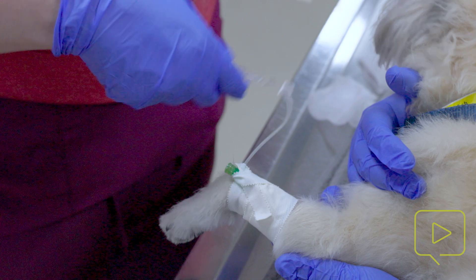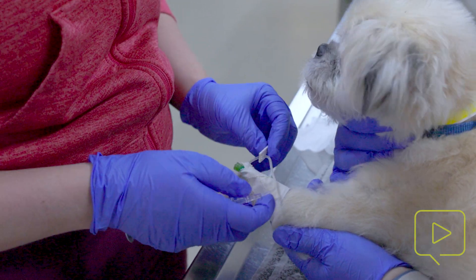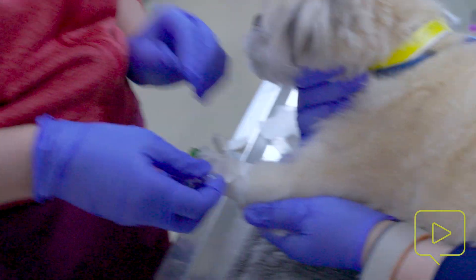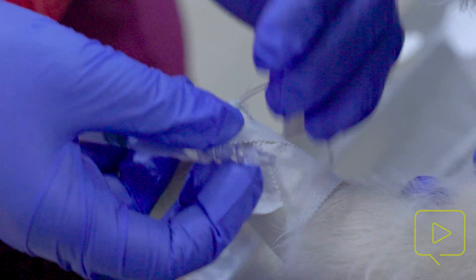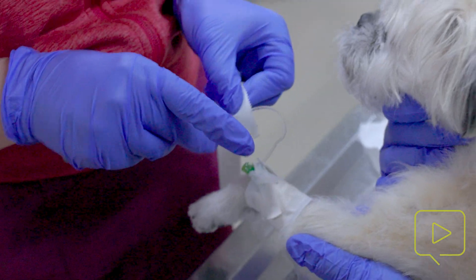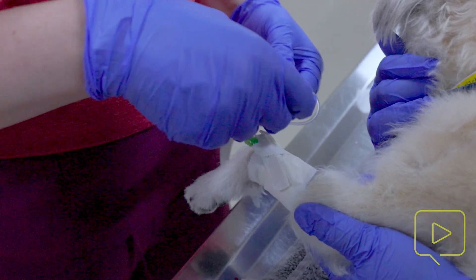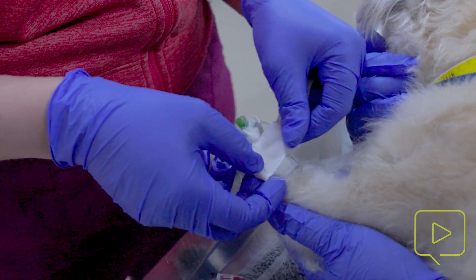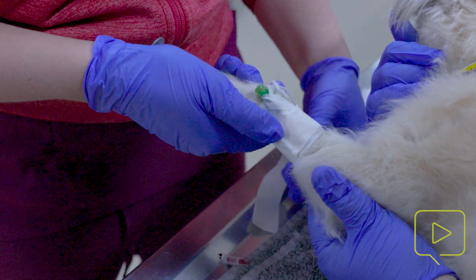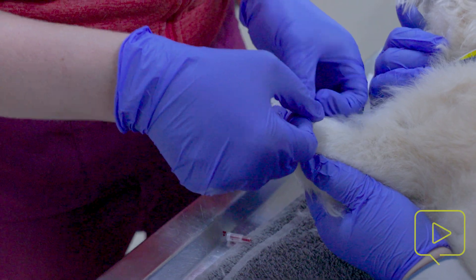I'm going to take this last piece of tape and horseshoe it. We have a clamp here that you can put in two different locations — up top or down below. My strong preference is down below because it gives you more room to wrap up the leg so it doesn't create bulk that creates weight and pulls it out. I wrap it again around the end of the T port, being careful not to cover the connection so that we can easily put an adapter or syringe on it. I horseshoe it to the other side of the injection port, wrap it around again — pull a little taut down here and lay it down gently — then just keep laying it gently and wrap it up. Courtesy tab at the end.